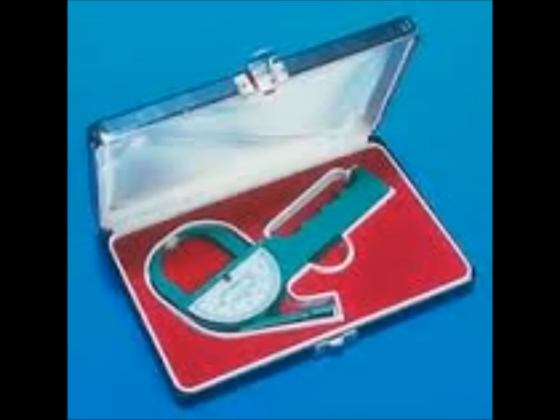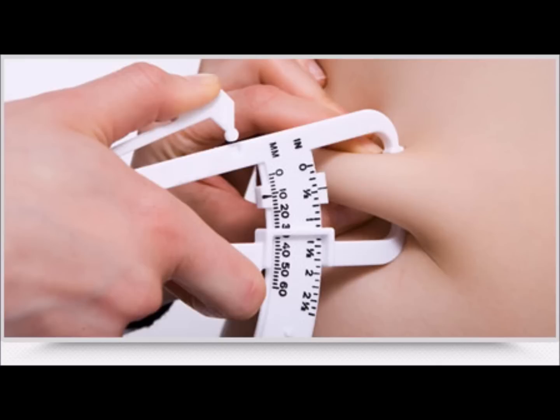When using a caliper, place it directly on the skin surface one centimeter away from your fingers and thumb. Make sure it's halfway between the fold and the crest, and maintain the pinch during the reading.